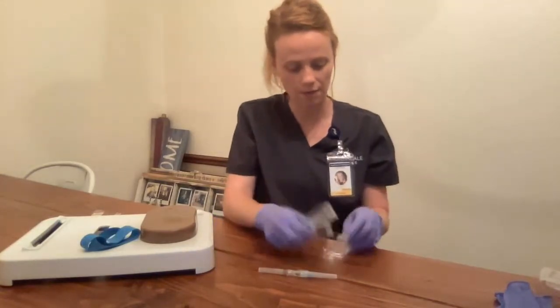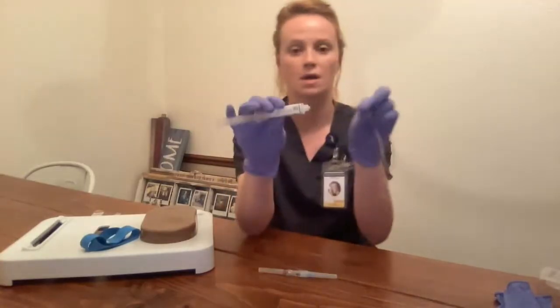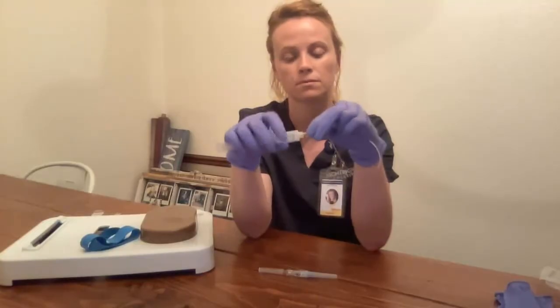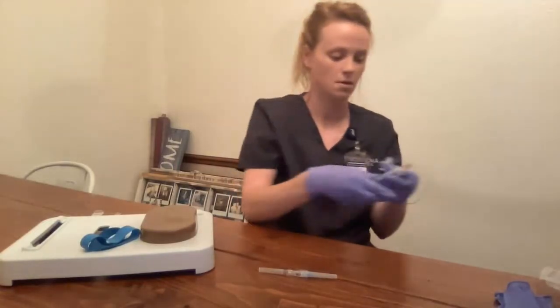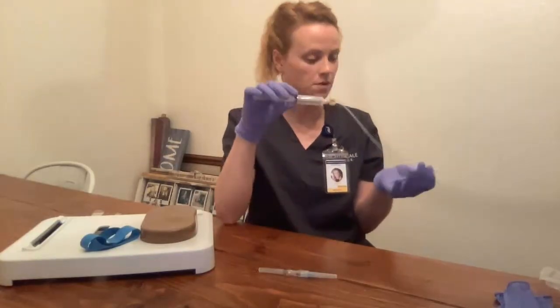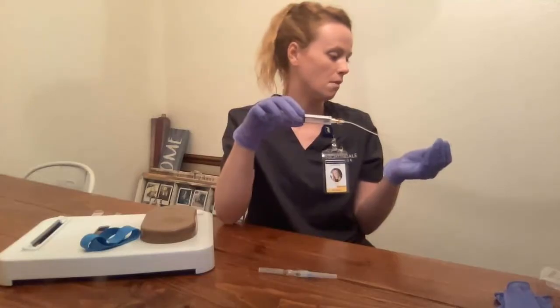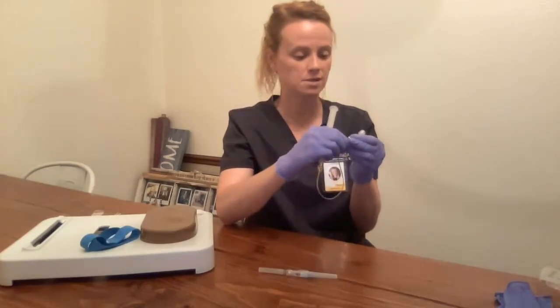I'm going to prime my tubing. I'm going to remove the ends here and attach. Remove the other end. Unclamp. I want to remove all the air bubbles from the tubing here, maybe wait for one or two drops to come out the end. Then I'm going to clamp this and put it aside.